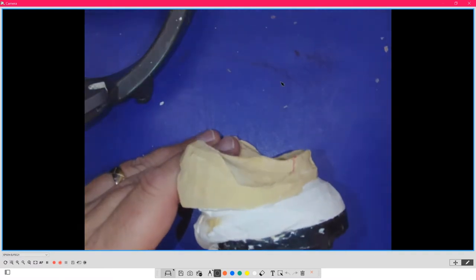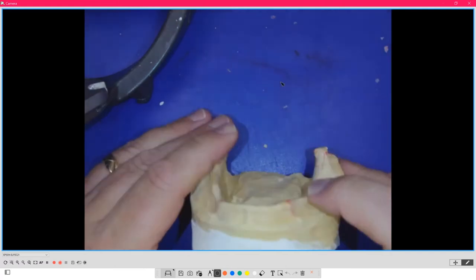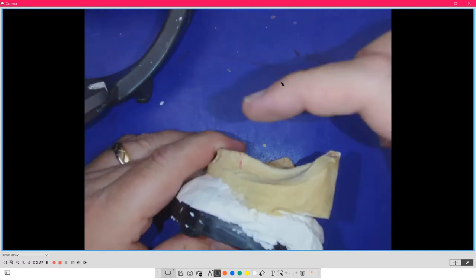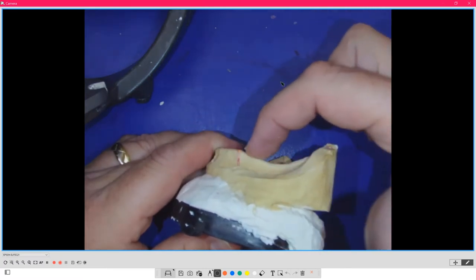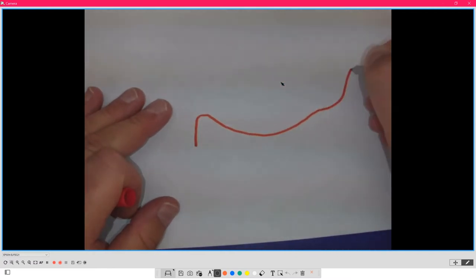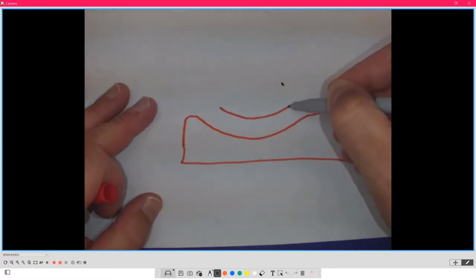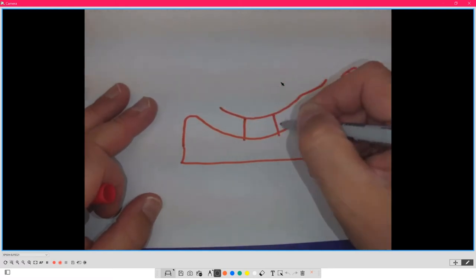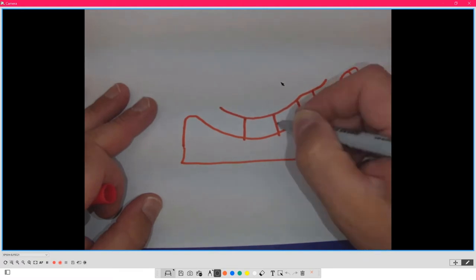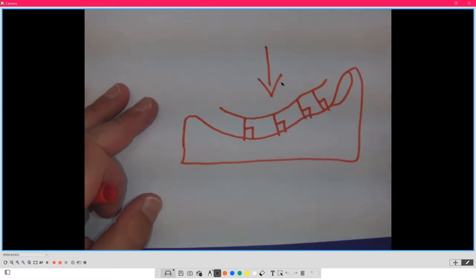Okay, so typically when we're doing a compensating curve, I try to set to that patient's ridge. This is a good one to show because we've got a pretty good dip here. In general, I'm trying to set teeth to this. The thought process is you have a ridge, there's the retromolar pad. I'm trying to emulate this so that the teeth are always contacting the ridge at a 90 degree angle to help push the denture down during function.